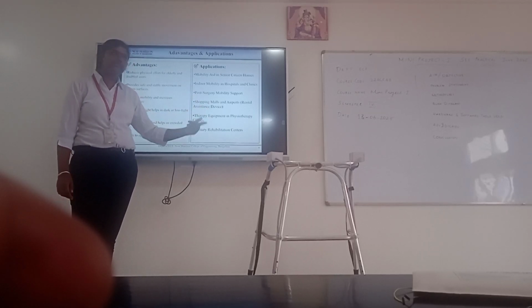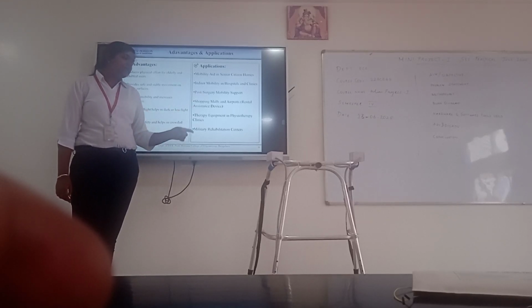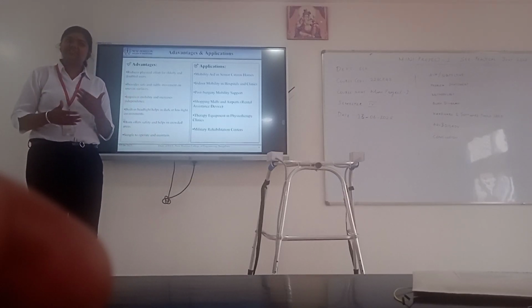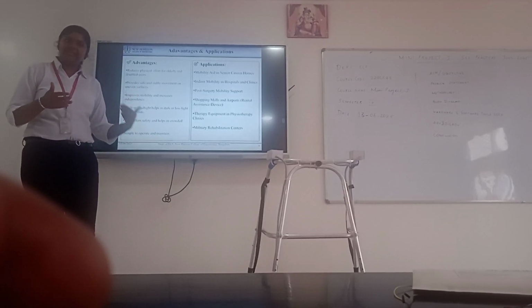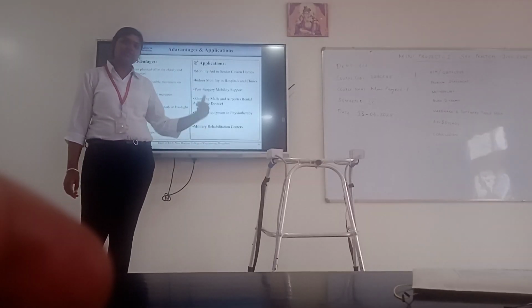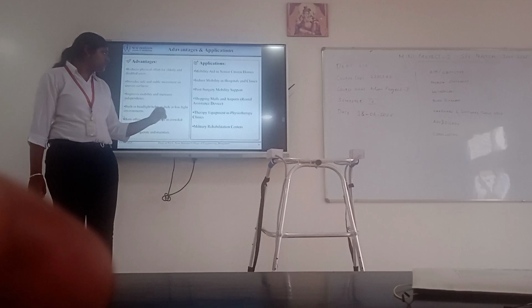Instead of nurses, they can use this. Then post-surgery mobility support here for the persons who are fractured. When one leg is not there, that person can use this so that they can move to far places and come back. They can use it for their work purposes also.